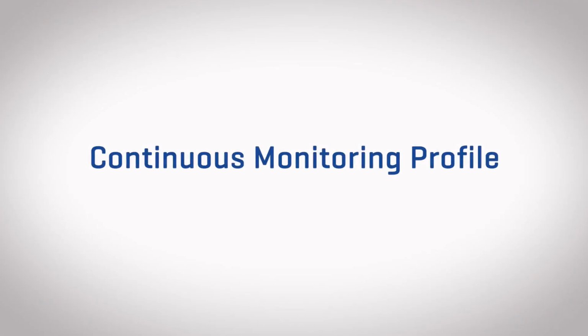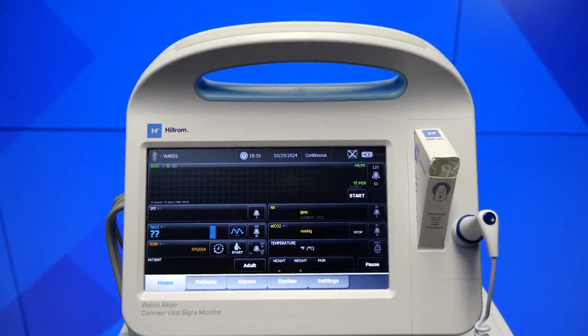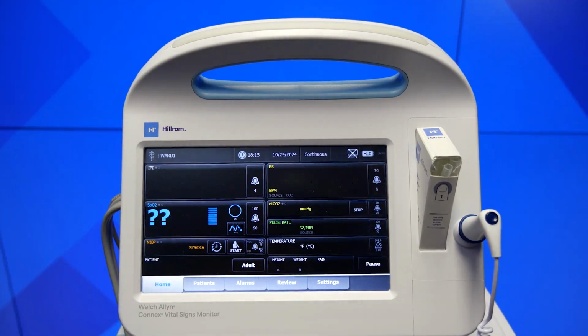Finally, let's review the continuous monitoring profile, which is designed to continuously monitor a patient. This profile also enables you to take manual temperature or NIBP readings, to use alarms and timed intervals, and to use bidirectional controls to transmit data between the monitor and a central station. The content area of the screen will dynamically adjust based on the configuration of the device and peripheral accessories attached.